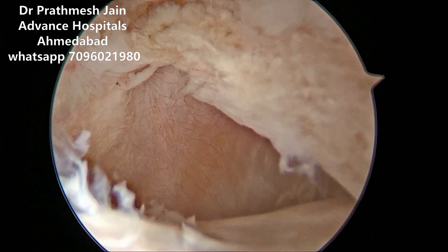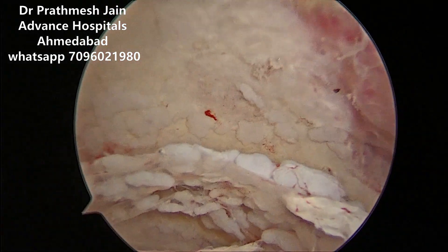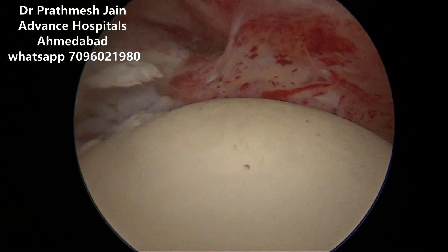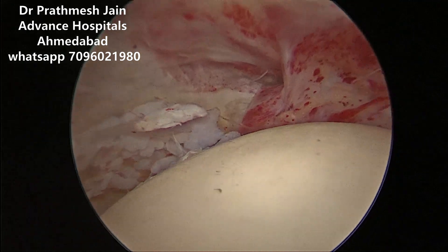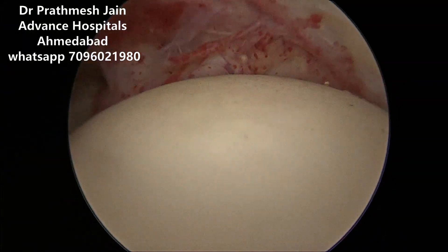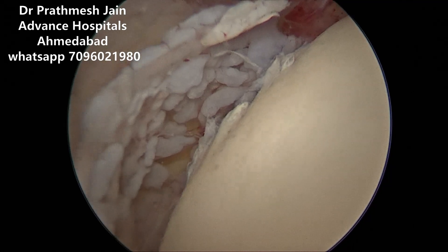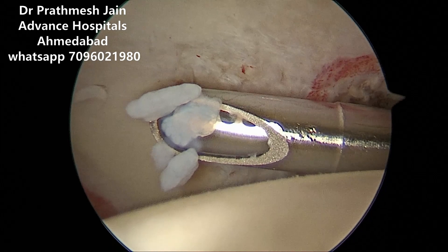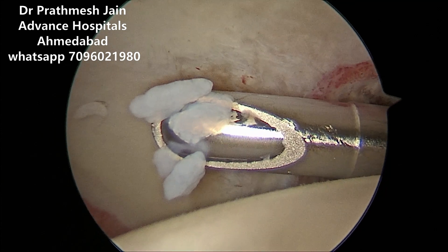We can see, after exposing the thick hip capsule, this is now the central compartment. This is the acetabular cartilage. You can see the pulvinar in the center, and there are large areas of small chondral fragments consistent with synovial chondromatosis. There is also a small chondral lesion on top of the femoral head — right at the center of the femoral head there is a big chondral lesion. There are fragments of synovial chondromatosis visible there. You can use your shaver blade to suction and remove this synovial chondromatosis tissue.